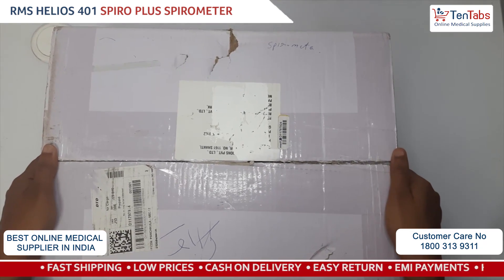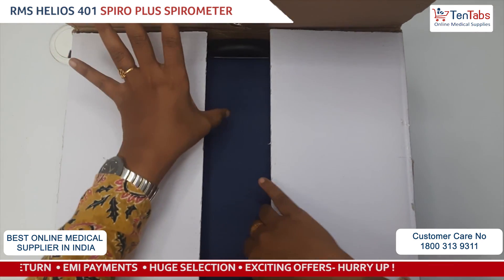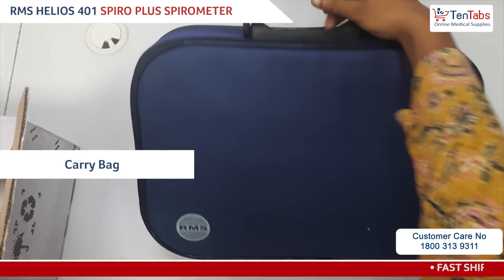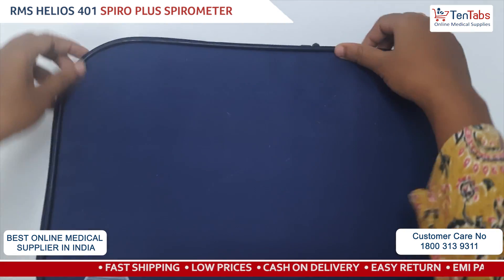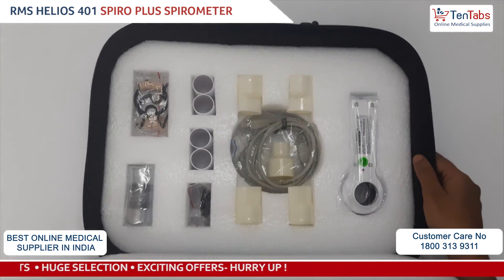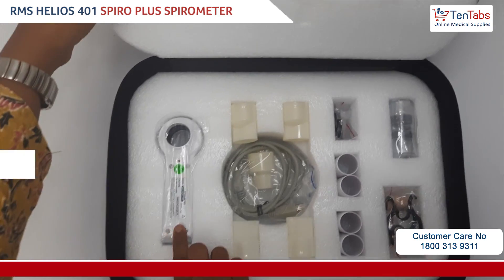Hi all, today let's make an unboxing video for the RMS 401 Helios spirometer. This is the carrying bag for the spirometer. Now let's see what is in the box.